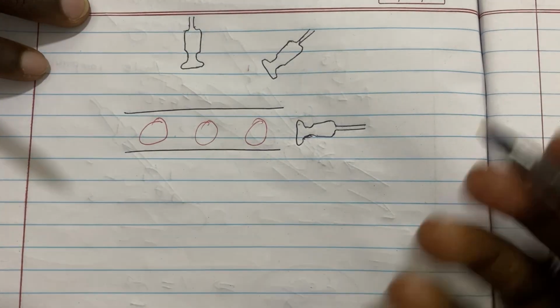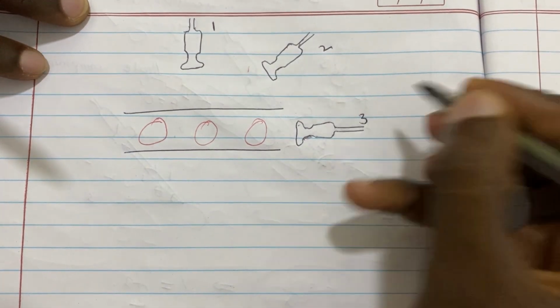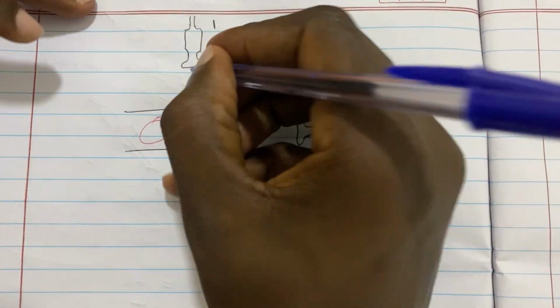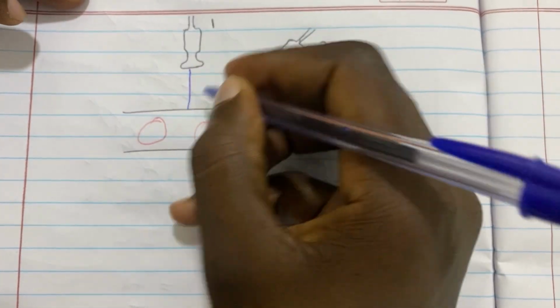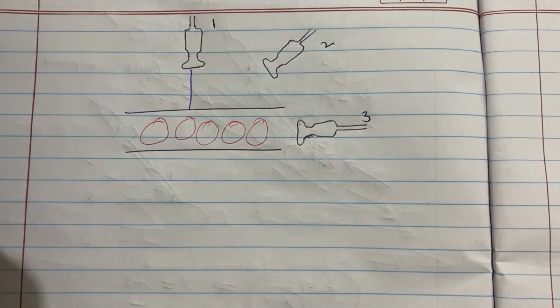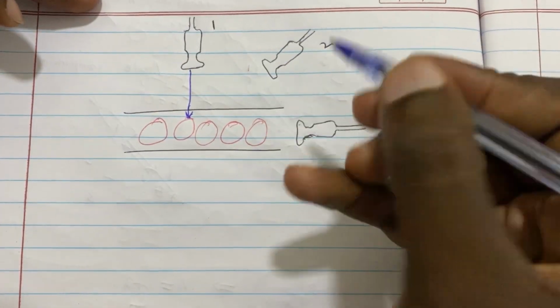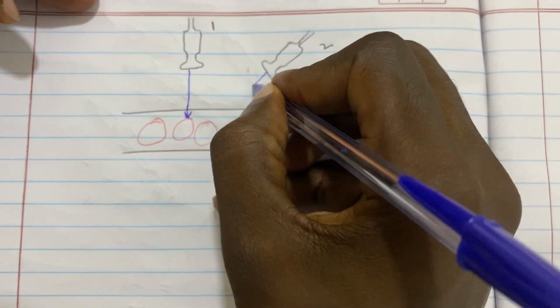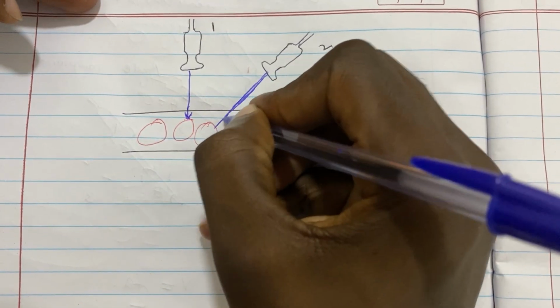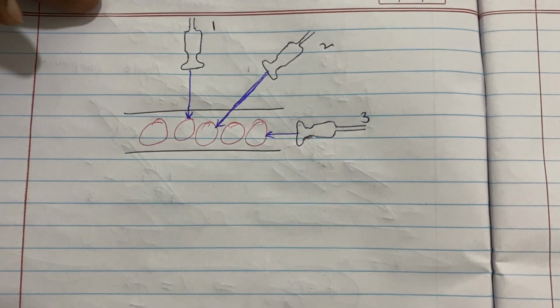This is our transducer. This is position 1, 2, and 3. It transmits. Maybe here we have another red blood cell. They are compact. It transmits here, and it transmits here.